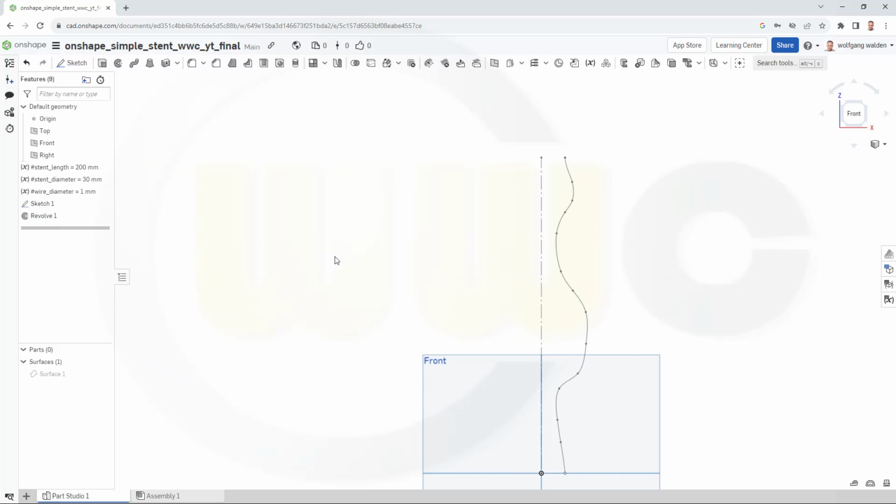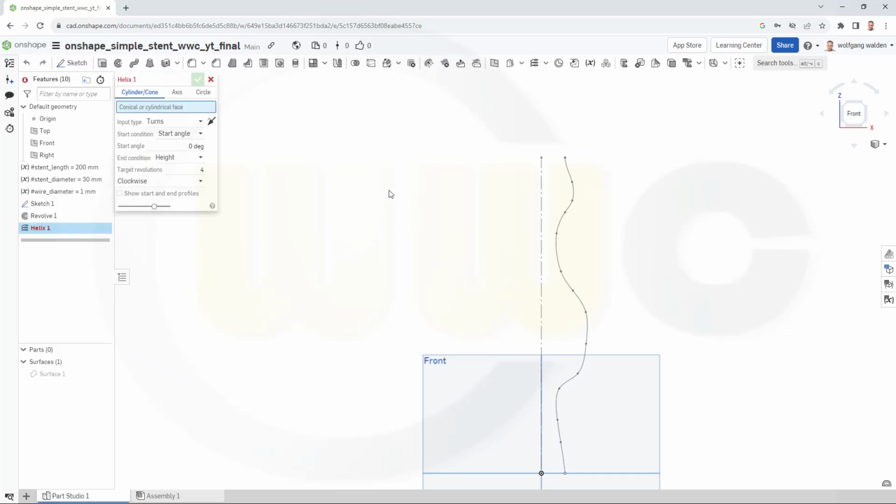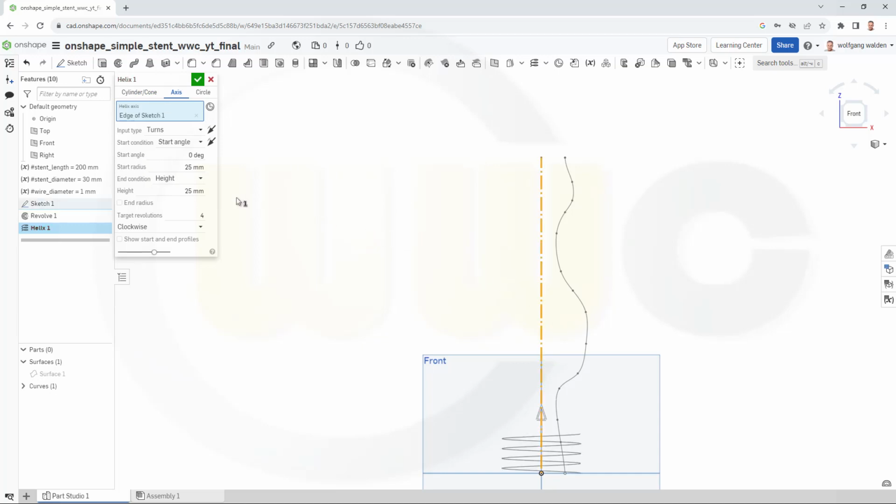I will need a helix. So let's go for a helix over here. I want to go for an axis. Axis should be this one. Yes. And I want to go for a height, and the height would be the stent length, hashtag stent length. That's okay. The start radius should be, in this case, I want to go for the stent diameter.